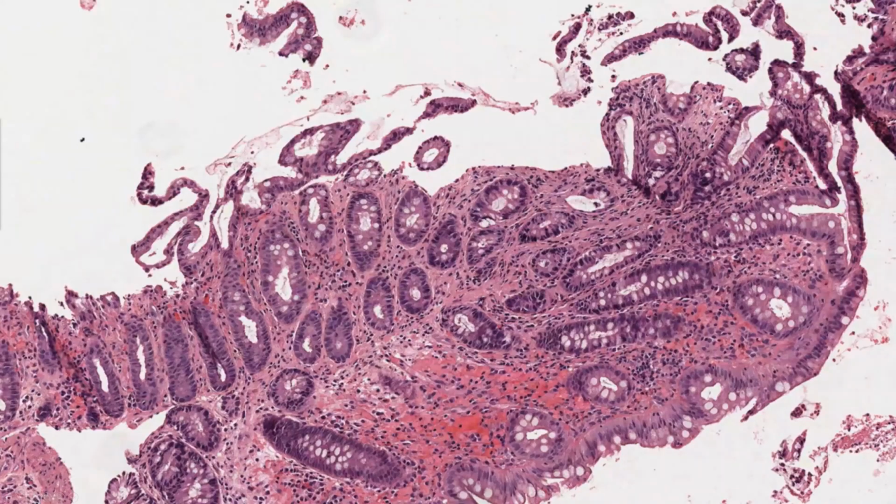And when I go to the edge to show you how genuine this tearing of the epithelium is, yes, definitely it is coming off. The lamina propria, especially in an area like here, looks like a more collagenous stroma. And that's not right, because it's normally a loose type tissue rather than a heavy-duty collagen like what we see.